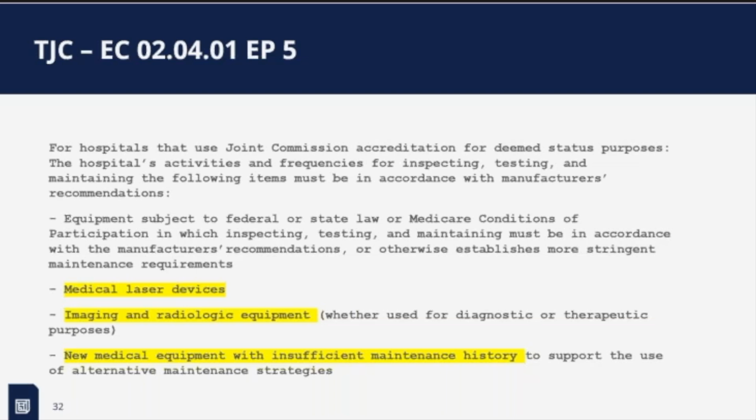Particularly in the biomed, the HTM world, it seems like there's always something new coming out. I've never repaired equipment, but I don't know how you guys keep up with all the different changes in the equipment and the new things. I think I heard one of our sites had at least 4,000 unique pieces of equipment that they have to maintain and do PMs on. That's another reason for AEM as well, because following OEM for all of those is tricky.